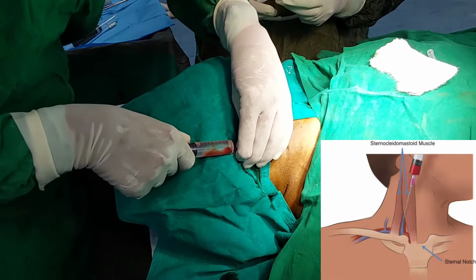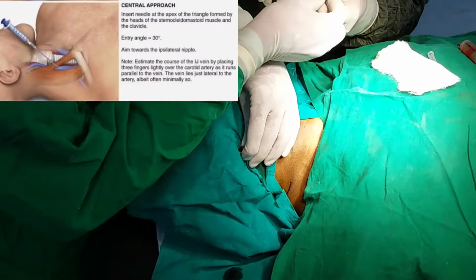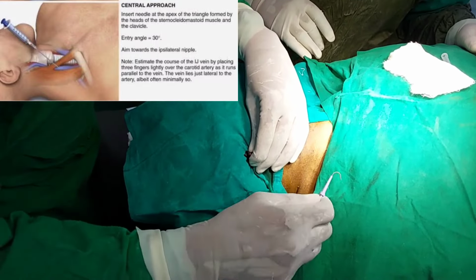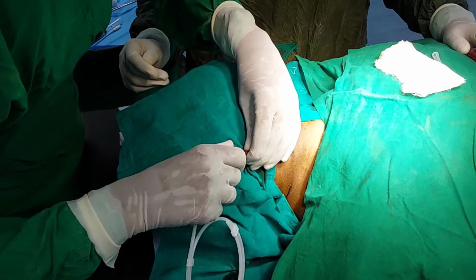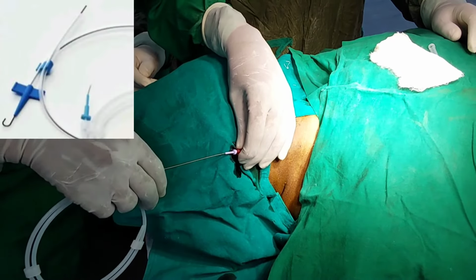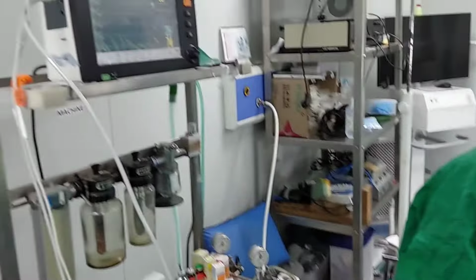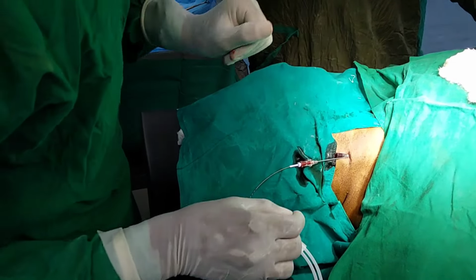The needle should be inserted at about a 30 to 40 degree angle to the skin at the apex of the triangle and directed towards the ipsilateral nipple, that is the same side nipple. Then after confirmation of the needle inside the vein, you have to insert the guide wire. The J-shaped tip should be inserted. Never use the other end of the guide wire. And you can see on the monitor that the heartbeat will increase.